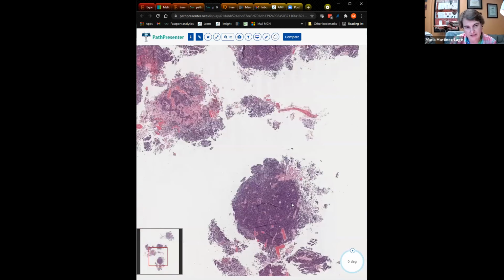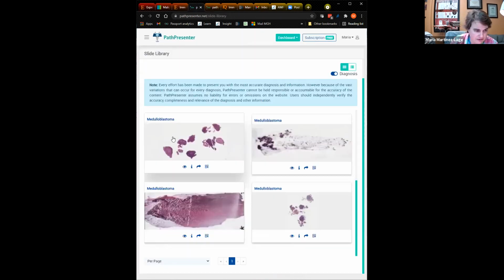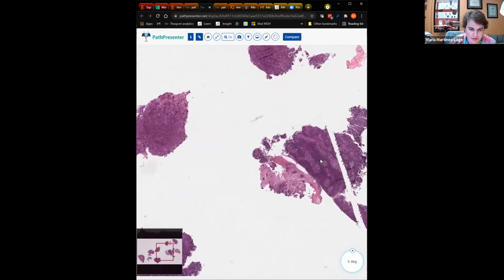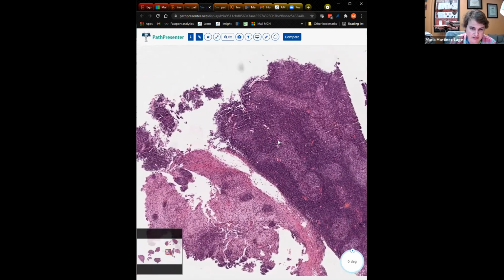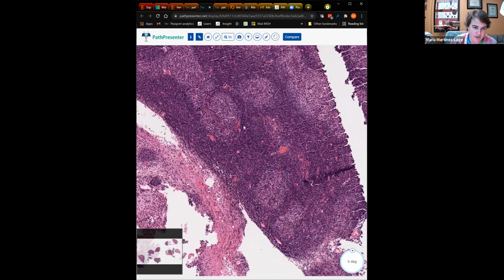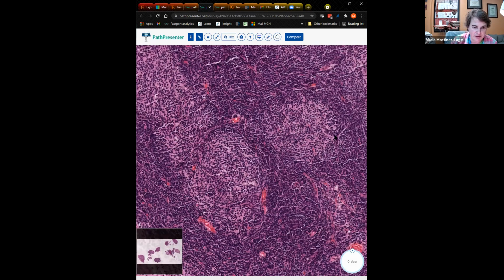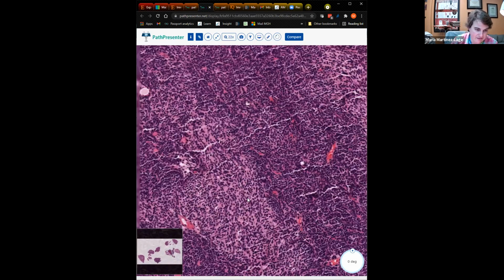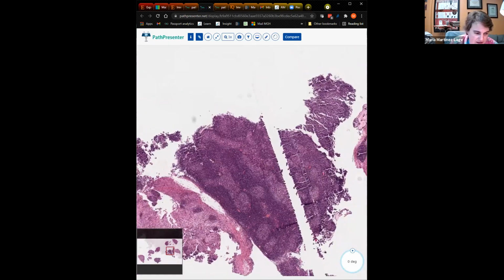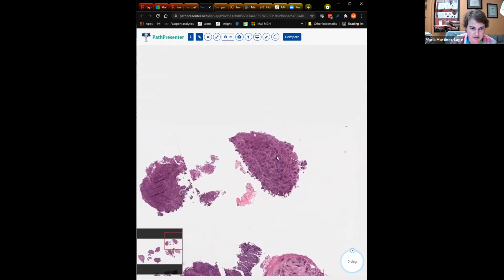Then there are 4 major groups of molecular classification of medulloblastoma. So medulloblastoma, oh look, here's one that has some degree of nodularity. See here, we have these paler islands that are intermixed with these solid areas of tumor in between. You notice that the islands have this neuropil in the background. And again, this looks like maybe it could be a desmoplastic nodular or a medulloblastoma with extensive nodularity.